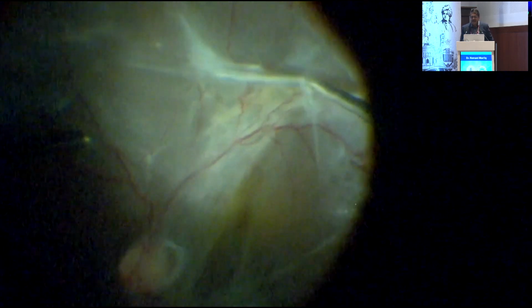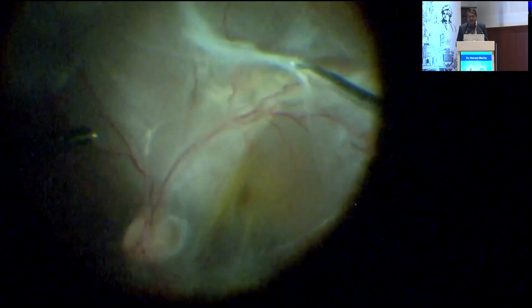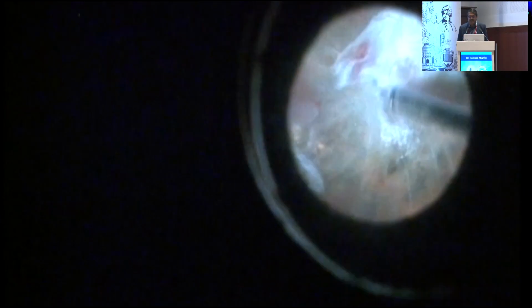So this is all just to show you what are the initial steps that you could adopt to help you identify the cleavage plane, because I know everyone keeps talking about it. So this is another tissue. You know that any further dissection is difficult.